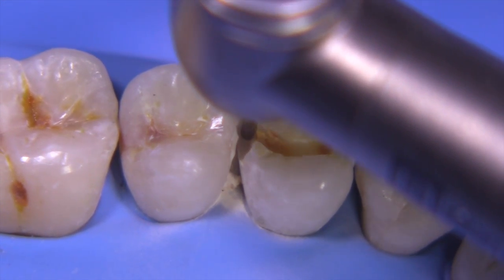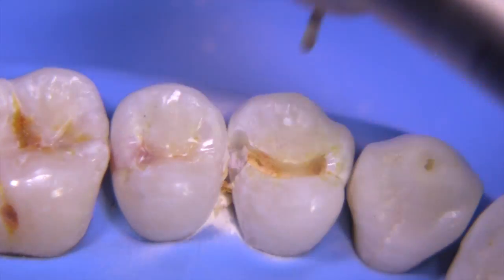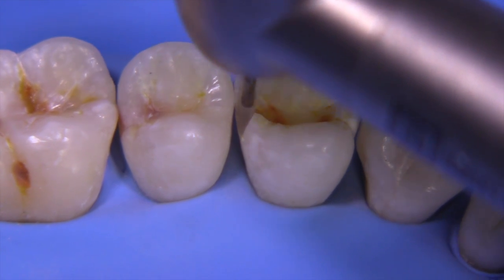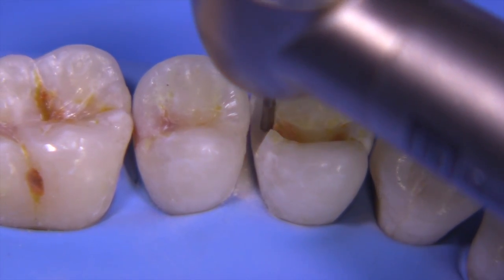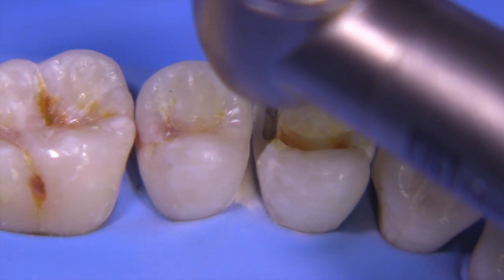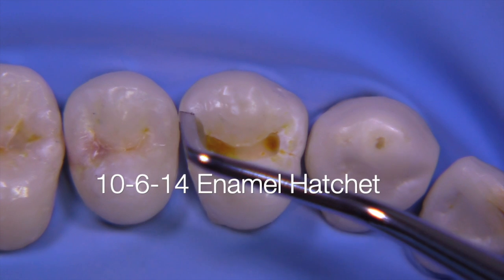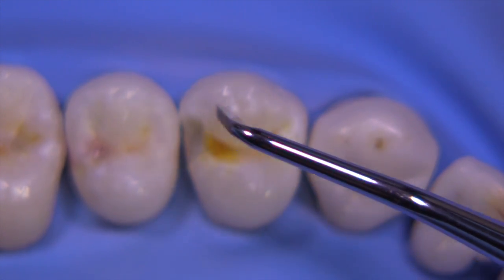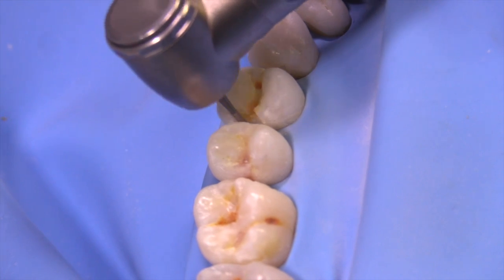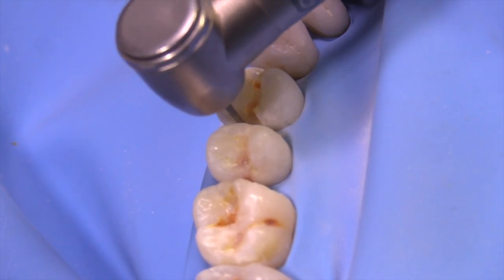Continue shaping the box, going a little deeper axially to get adequate depth into dentin. Breaking facial contact is oftentimes really challenging on maxillary premolars because you're usually transitioning between the proximal surface and the facial surface. In a situation like this, it's a good idea to try to undermine some enamel and then chip it away with a hatchet if you can. We go at it again with the enamel hatchet and achieve success after the contact is broken on the facial.